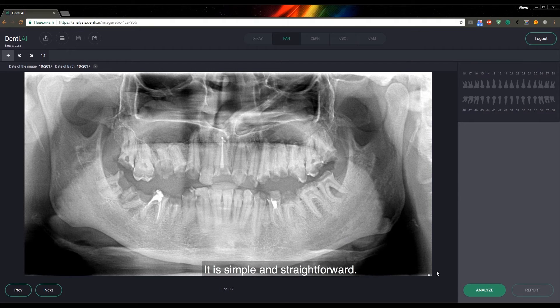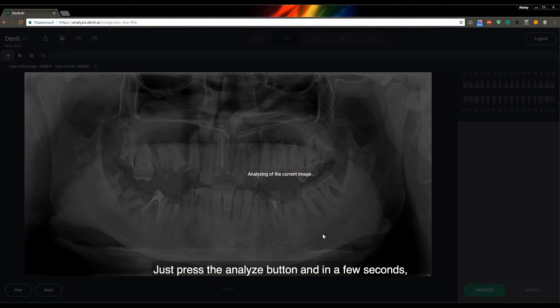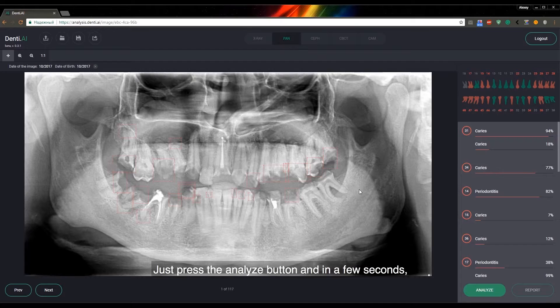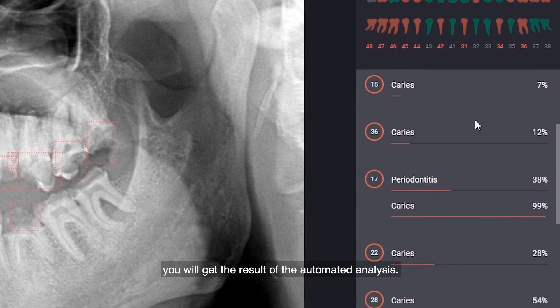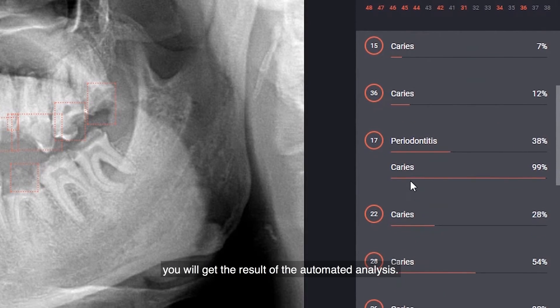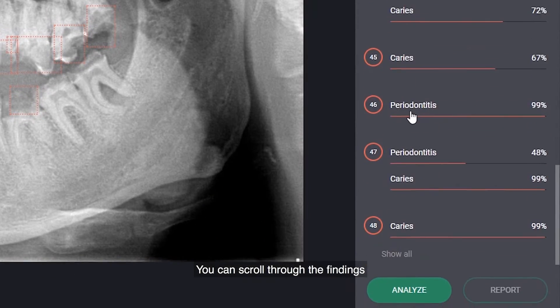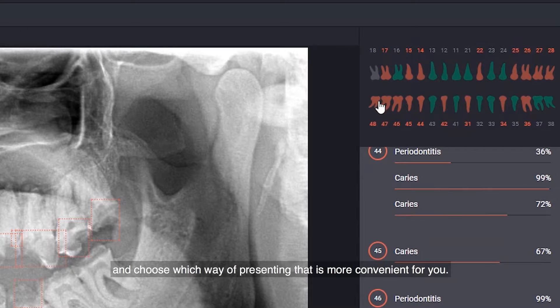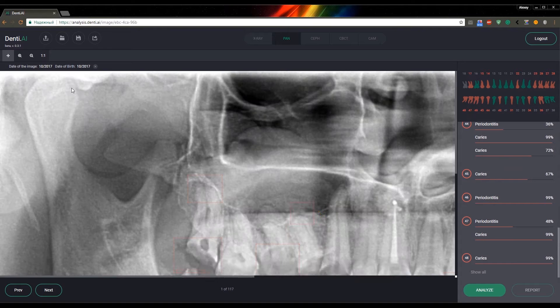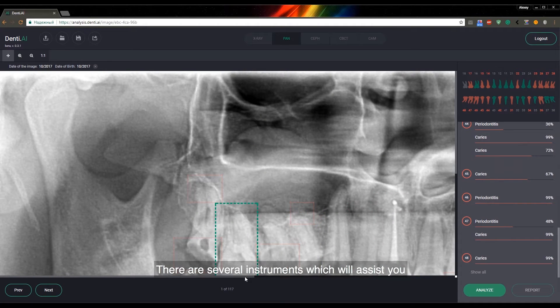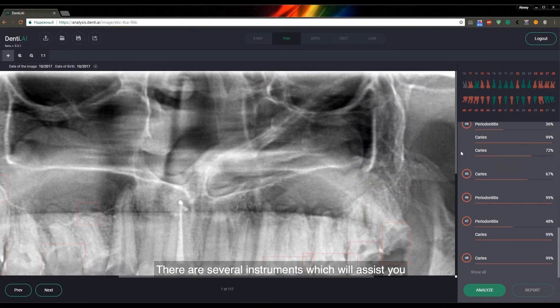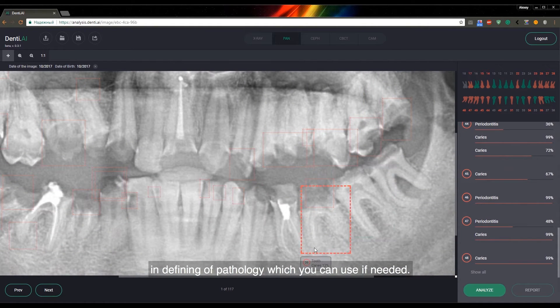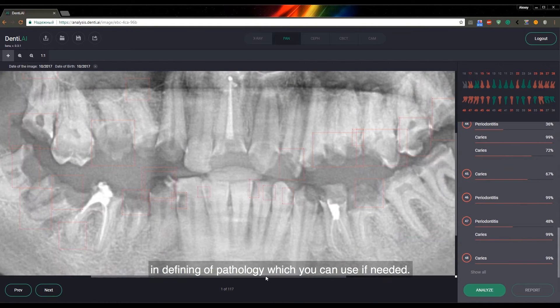It is simple and straightforward. Just press the Analyze button and in a few seconds you will get the result of the automated analysis. You can scroll through the findings and choose which way of presenting them is more convenient to you. There are several instruments which will assist you in defining pathology, which you can use if needed.